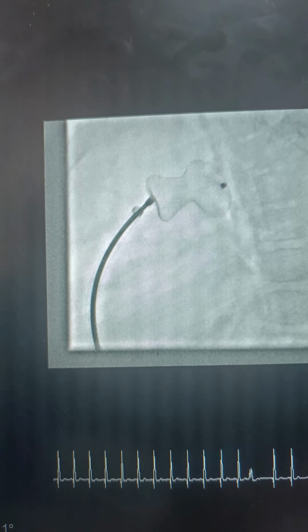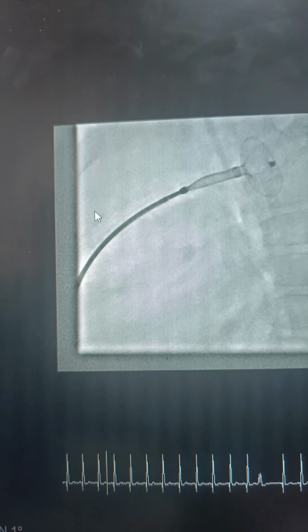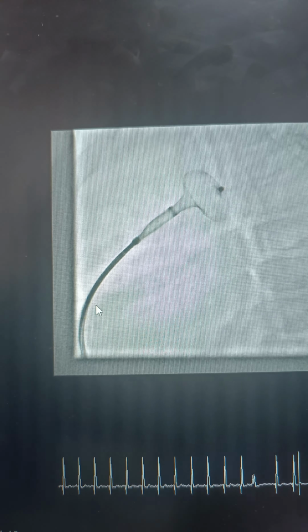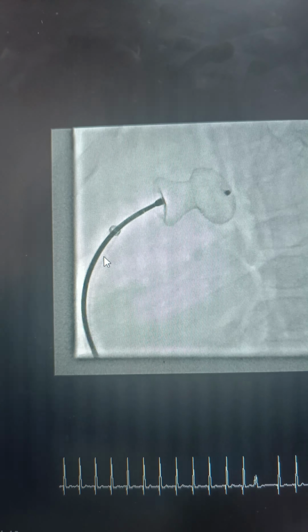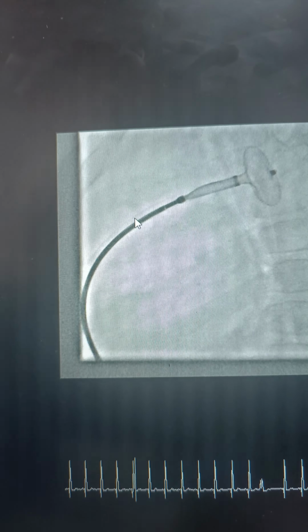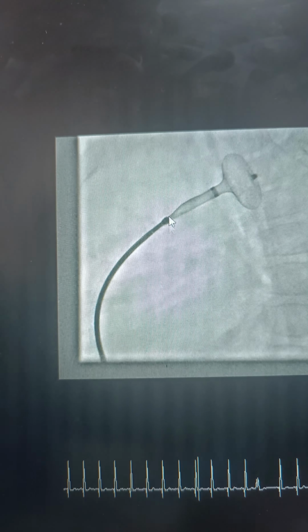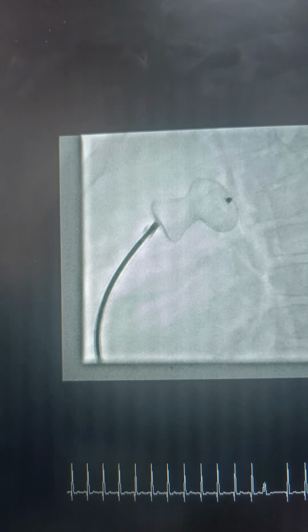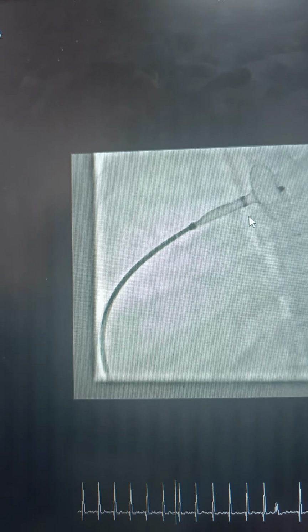And catheter is through? So this catheter is actually a 10 French LifeTech delivery sheath that I have taken from the femoral vein to IVC to RA to RV across pulmonary valve, then from the LPA to PDA to aorta. So currently this sheath is in the LPA. The tip of the sheath is in LPA. So first you have taken the tip of the sheath up to the aorta through the PDA.